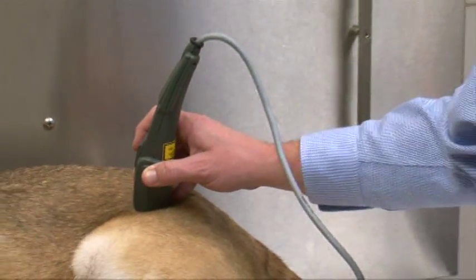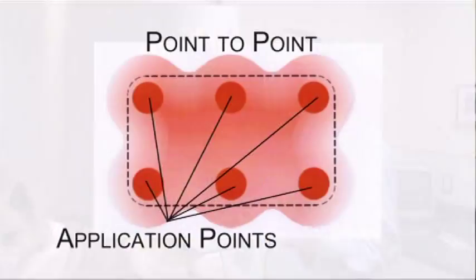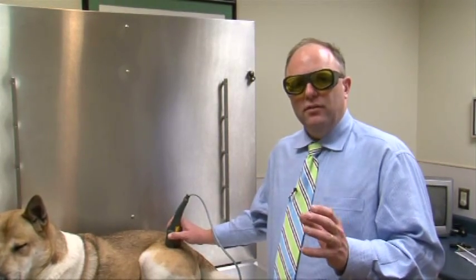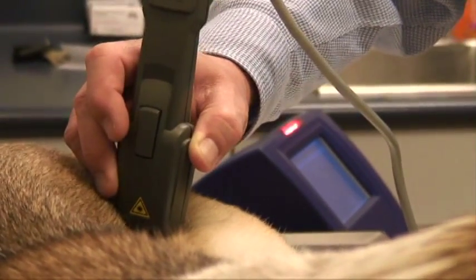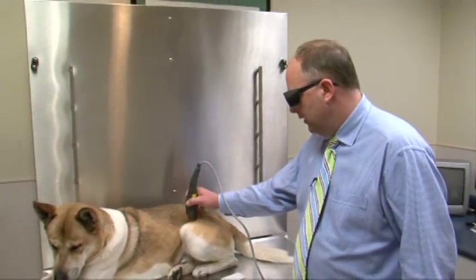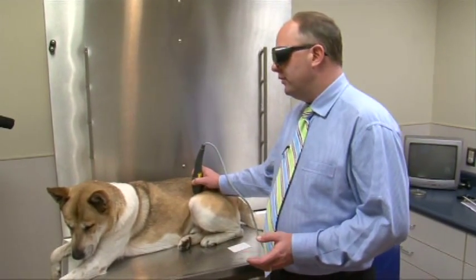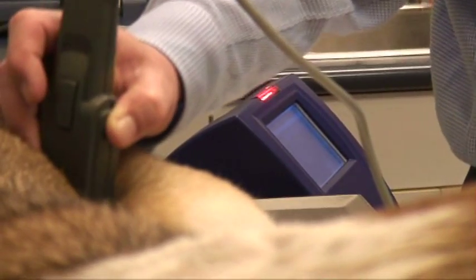We're now approaching the end of a minute of treatment time, so I'm going to move to the third area. Point to point and scanning can be used interchangeably. Point to point is going to be a little more effective when you want to address deep-seated pathologies or need greater penetration. Each indication is listed on the menu for both point to point and scanning. What we've found is the first treatment is always going to be most effective on point to point because it penetrates a little deeper. Then, depending on the condition and where the pathology is located, we recommend alternating point to point and scanning. If it is a deep-seated pathology you're looking to address, we recommend continuing to use point to point since that's going to penetrate a little deeper.